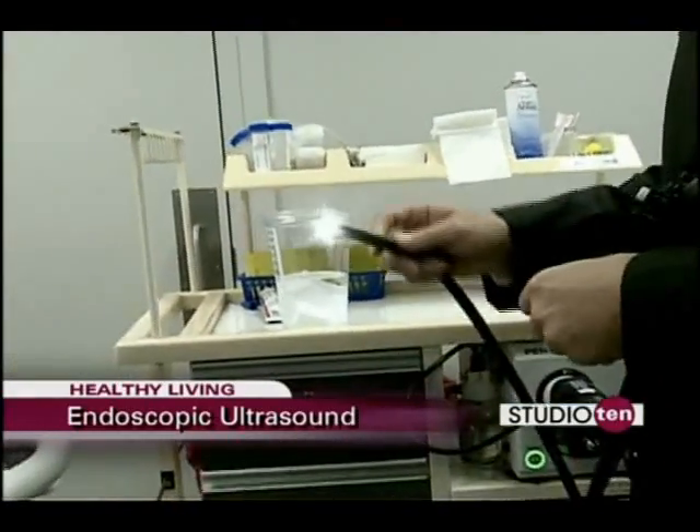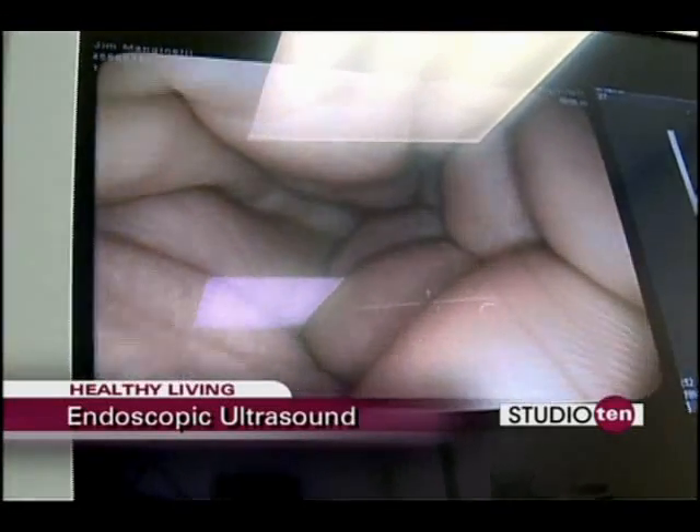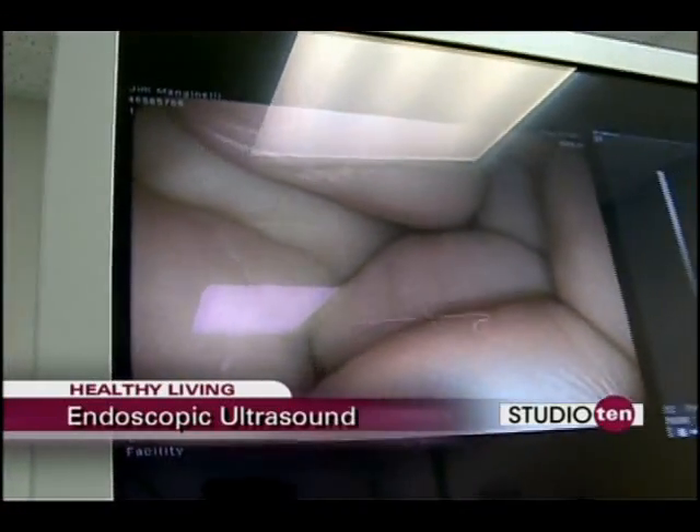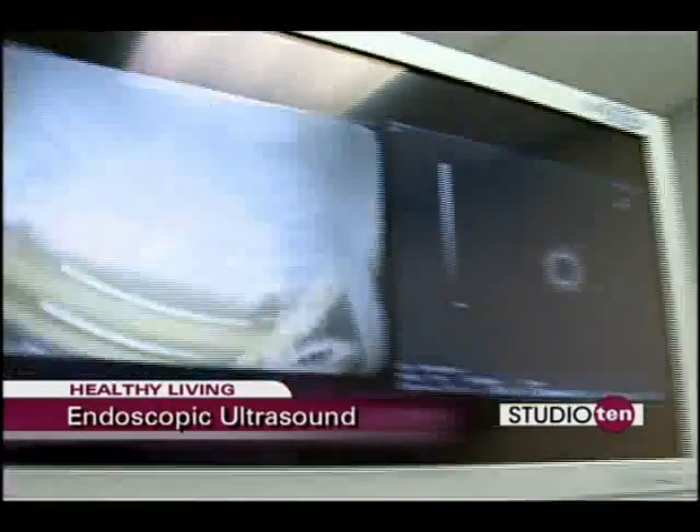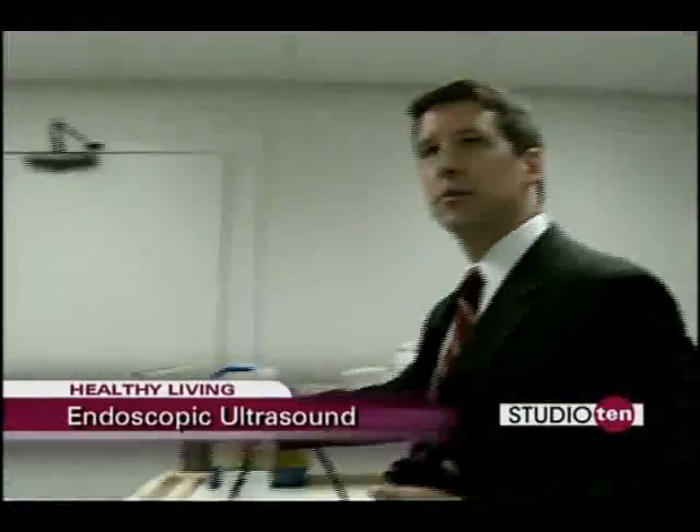You can see, as we press this, we can see images of my hand. So you have a nice endoscopic image, and then at the same time, on the image to the right, we can actually see the ultrasound images.